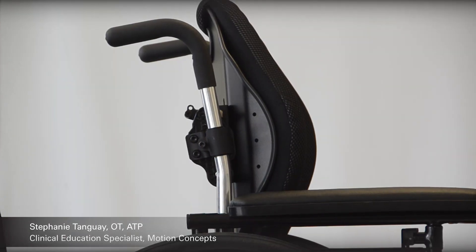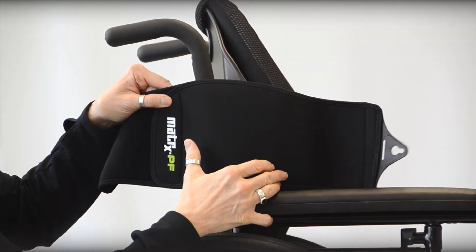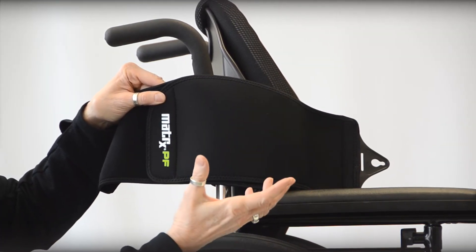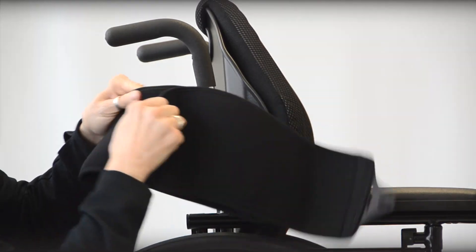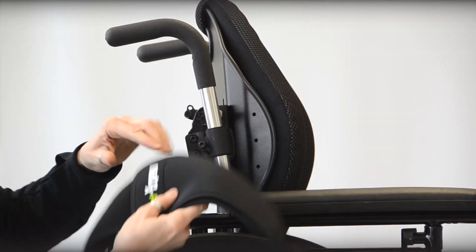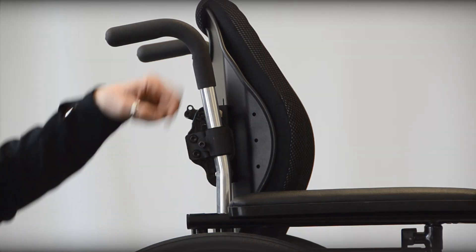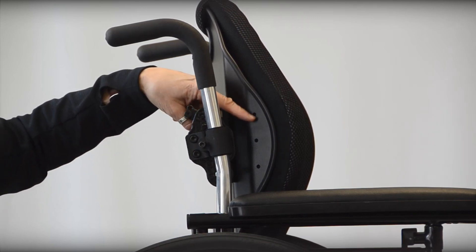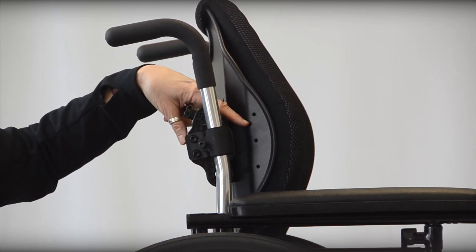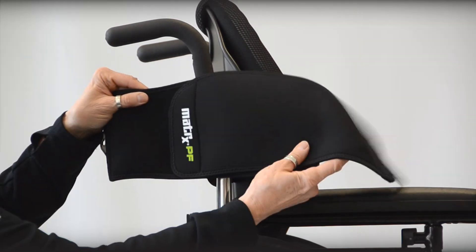One of the accessories available for the E2 and E2 Deep backs would be the Posture Flex. This is an anterior support available in a couple of different sizes. It gives you a slightly elasticized hook and loop close anterior support that can be easily added to any of the E2 or E2 Deep products. You will see in the lateral contouring on both the standard and deep E2 pre-drilled holes, which are your attachment point sites for the Posture Flex.